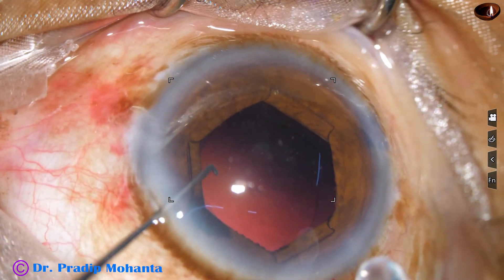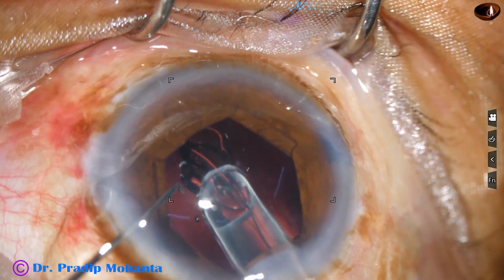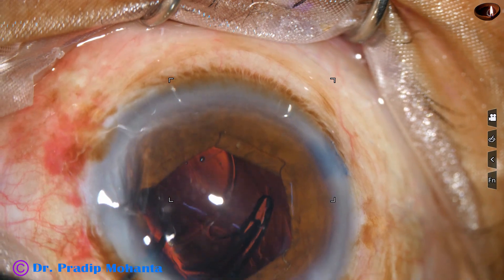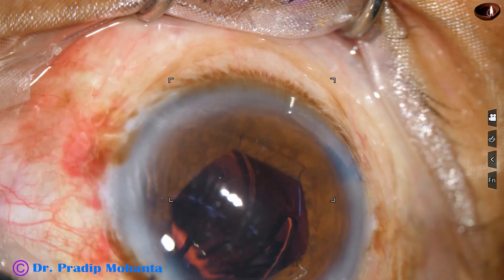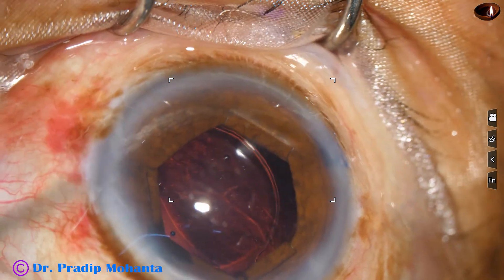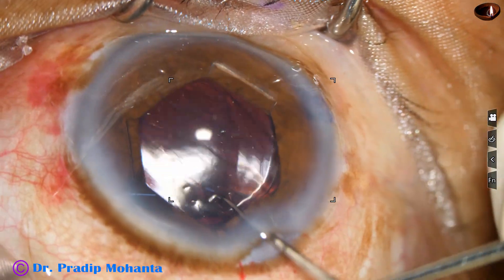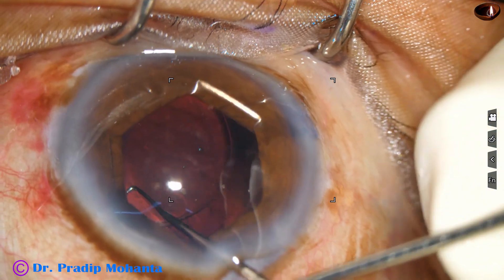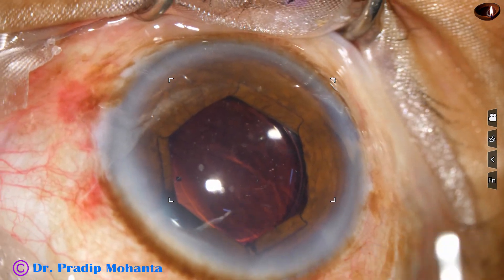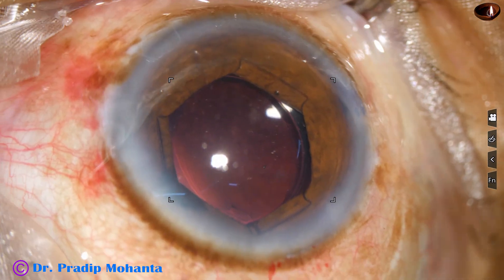Now the lens is being delivered into the capsular bag. In this case, we should take care that the trailing haptic should not get caught on the B-Hex pupil expansion device, and the B-Hex should not go into the capsular bag. It is nicely placed. Now we have to remove the visco, and before that we have to remove the B-Hex pupil expansion device.